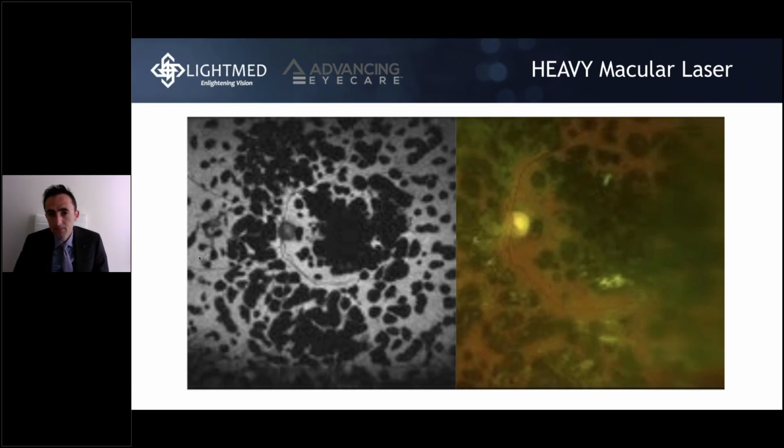A lot of people who maybe use SP mode or are newer to SP mode, I've heard there are questions about how do you know whether or not it's effective if you can't see the burn? That's a great question. In the beginning, when I started using the SP mode, I was like, am I treating? Am I not treating? It was a little bit of a shady zone. But when I saw the effects of the treatment for the patients in about 4 or 8 weeks, I was convinced that it works. And I think it never harms to try a couple of treatment sessions with the SP mode, 5 or 7.5%. Even when you don't see a laser burn, you don't want to see a laser burn in the central part of the macula. Just give it some time, like 3 to 4 weeks, and repeat the OCT picture using the progression mode on the Heidelberg.